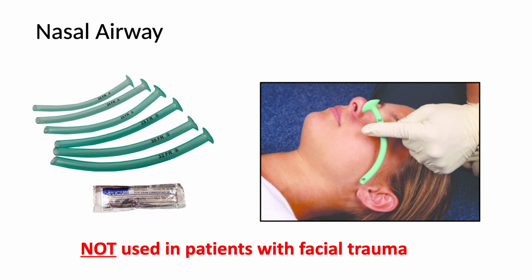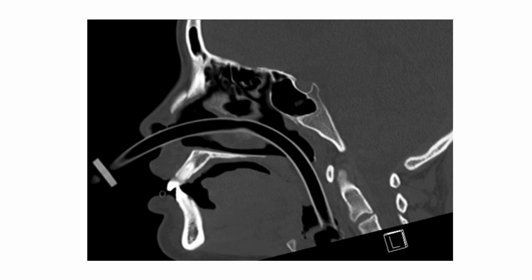Again, I always try positioning first, but if you need to, and this is just a difficult patient with difficult anatomy, these can be a nice adjunct to your treatment. One important thing to consider with these is sizing, and the minute you're handed these, you learn about the importance of it.